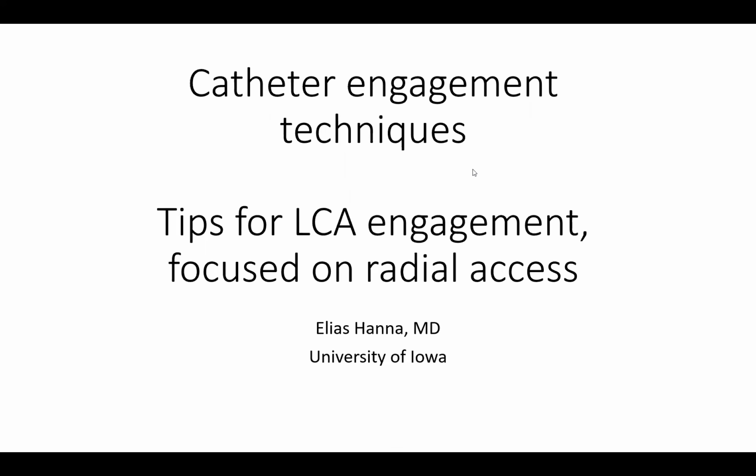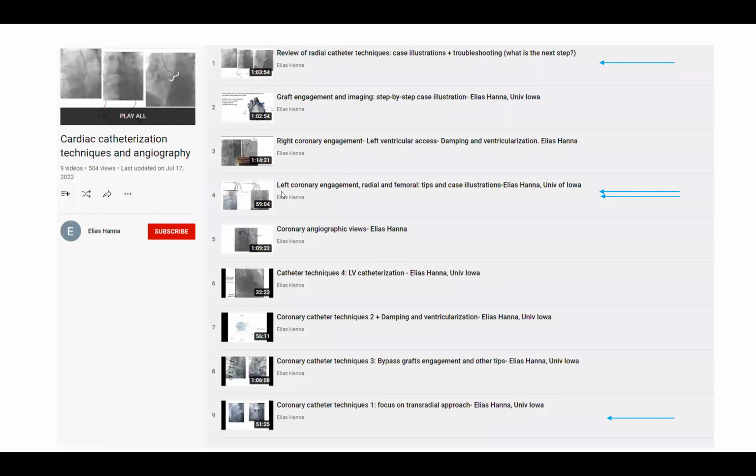I will talk about left coronary engagement, particularly focus on radial access with general tips as well. I have provided such talks in the past, and I suggest you review those under my YouTube channel, cardiac catheterization playlist, particularly those 3 talks I highlighted here, especially that one from a year ago or so, left coronary engagement. In each of those talks, I try to change cases, update illustrations, so you can have a library of illustrations, and all of the talks remain relevant for you to review and get some experience.